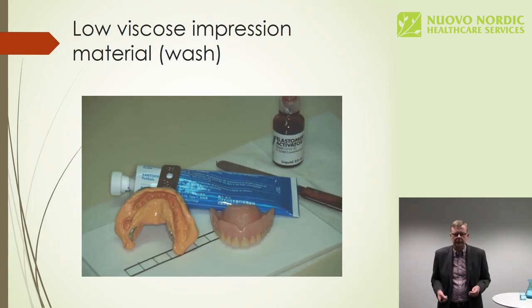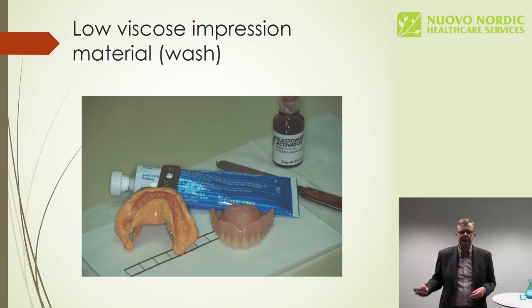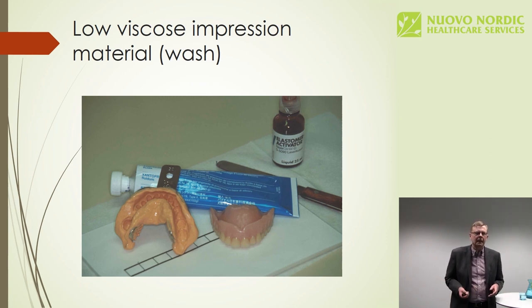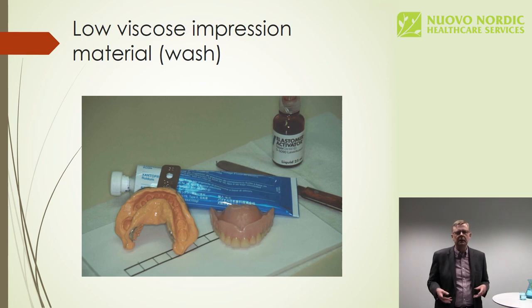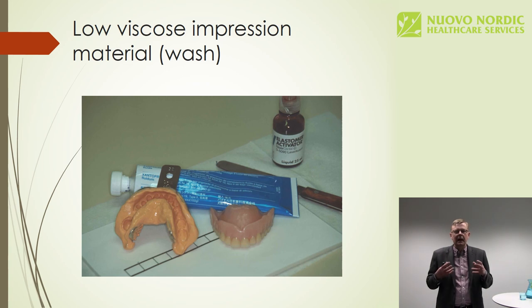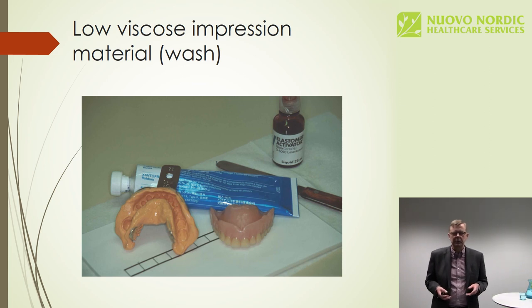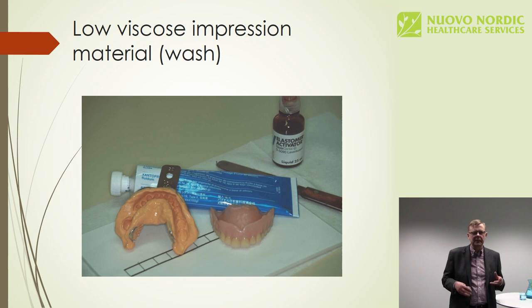For the actual wash impression, or the final impression, we'll use light body impression material, or as it's sometimes called, wash, which means that we are pretty much trying to achieve an anatomical impression of the tissues. The pressure areas will be at the borders, if there are any. However, the palate, the ruga area, will be impressed with wash, and not so much pressure will be directed on those tissues. Of course, now as we have no spacer, there will be some pressure.